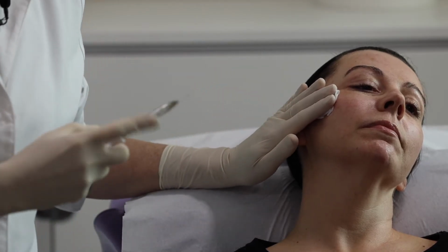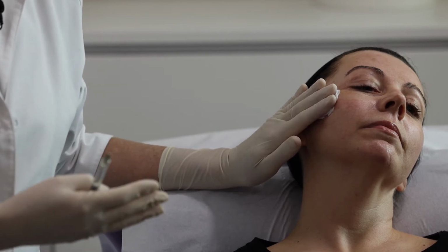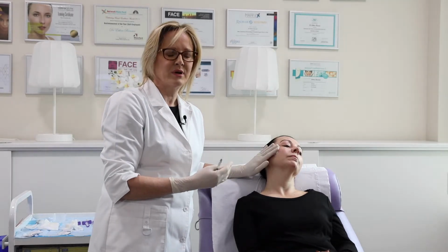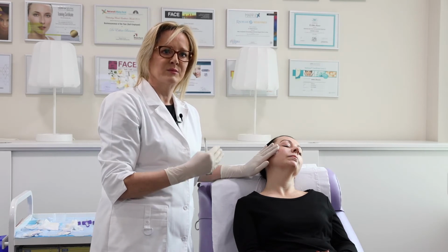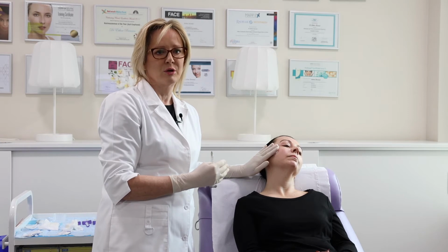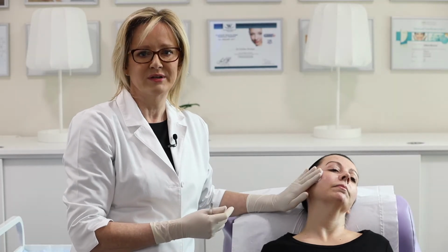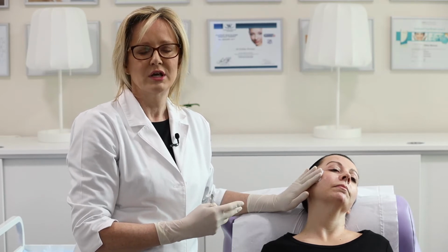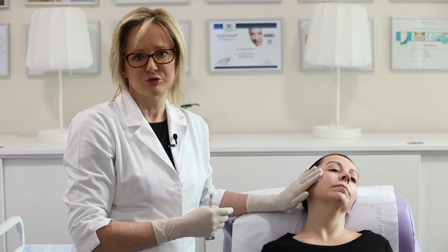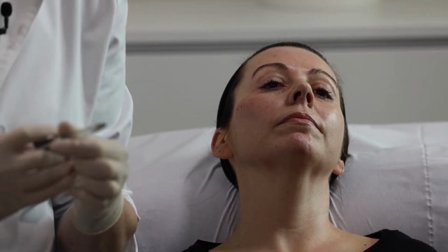CK1 has several benefits. It improves the lid-cheek junction, it'll improve the lateral brow, and it'll improve the temporal area. It gives some improvement in the nasolabial fold, and it can improve the oral commissure as well. So CK1 is really that central foundation of the mid-face, and it's a very useful point that we use in men as well as women to get lift and also to improve the contours of the face. I'm using Voluma for the CK1 codes.